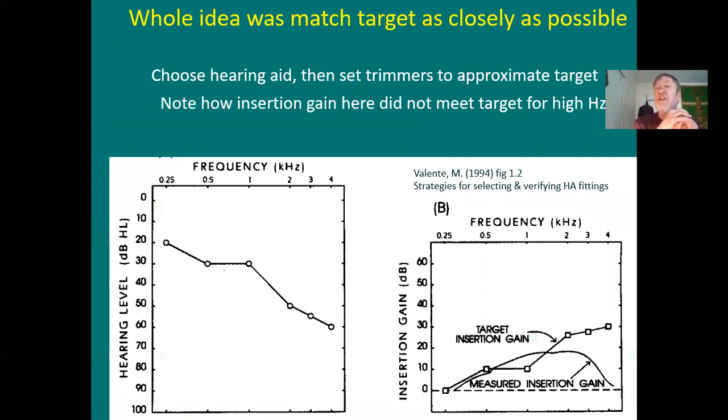The whole idea in old real ear, in yesterday's real ear, was to match your target as closely as you could. You choose the hearing aid, then you set the trimmers or the adjustments on the hearing aid to approximate your target.